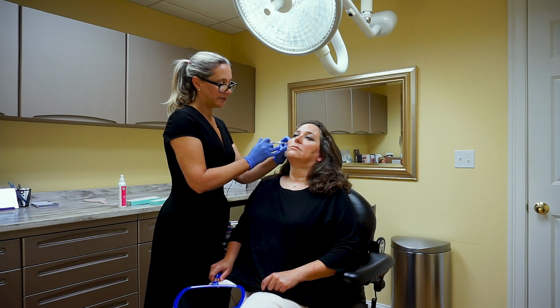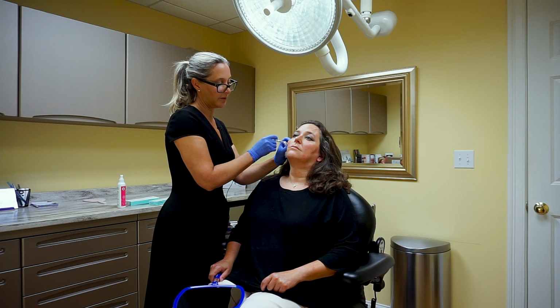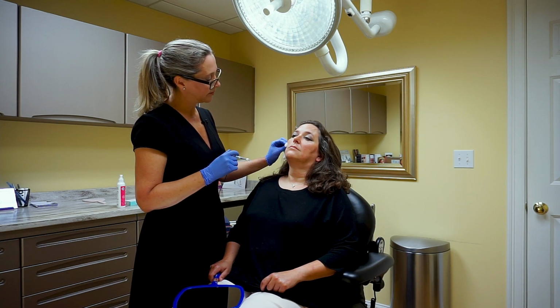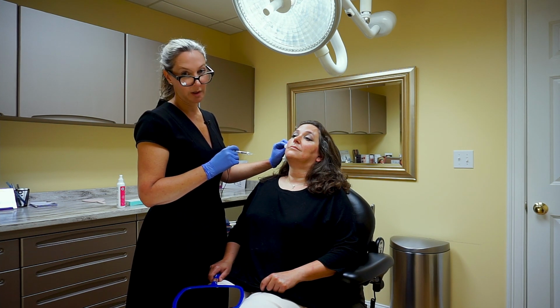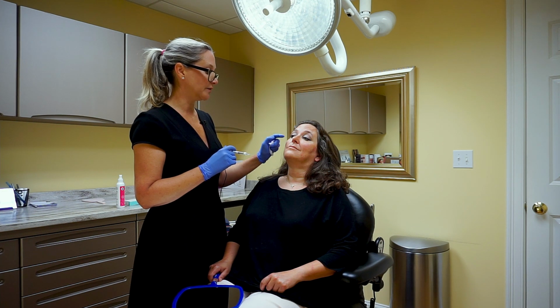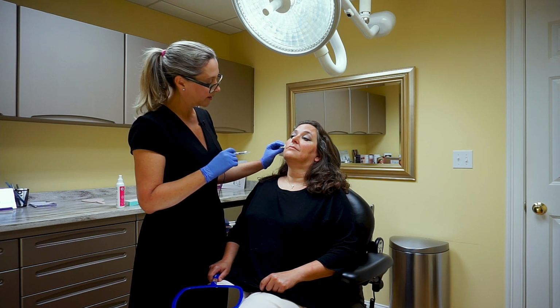I'm going to come out lateral to give it a little bit of drama, and this really depends on how somebody feels about it. I know Jody likes to have a little bit of drama in the cheekbone, so I put a little bit more lateral. If somebody wants less of that, I'd march it in a little bit more.